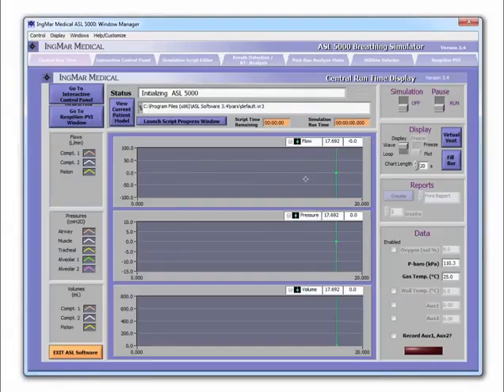There are two types of individuals that we're trying to focus on today. One would be the simulation facilitator or sim jockey, the person that needs to just understand how to apply the different lung states within a simulation. And the second would be more of the simulation creator, or someone who would write the simulations or create the lung models. So let's talk about if you are a simulation facilitator.